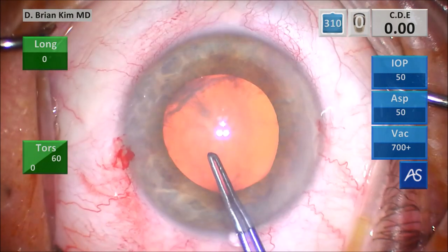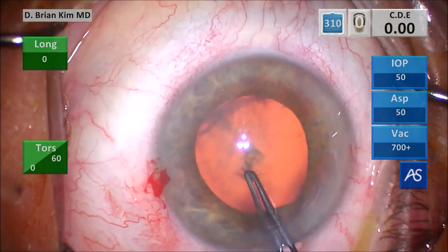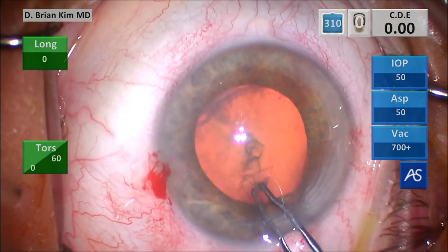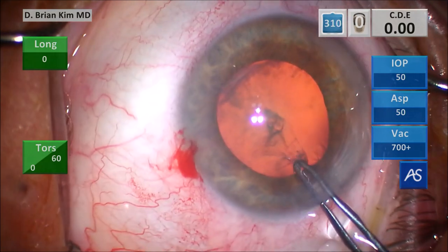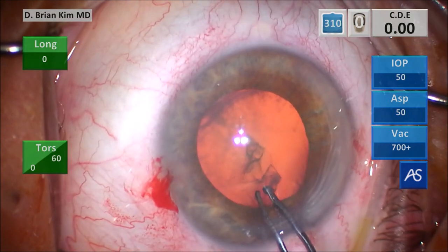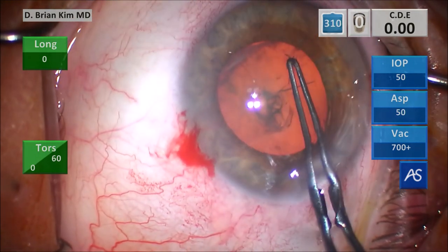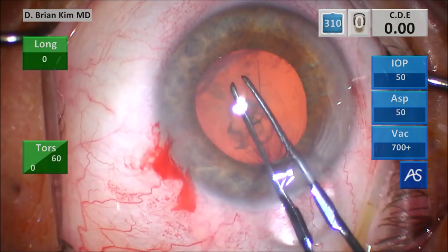I use the forceps to puncture the center, pull down and try to redirect the tear toward me with the teeth together, grabbing the right side of the tear which creates the flap. Then I go ahead and grab the flap going around circumferentially, using the corneal mark that I made prior to guide me on the size and centration of the rhexis. Whenever you're dealing with a smaller pupil, you always have to be mindful about the capsular bag and the zonules.